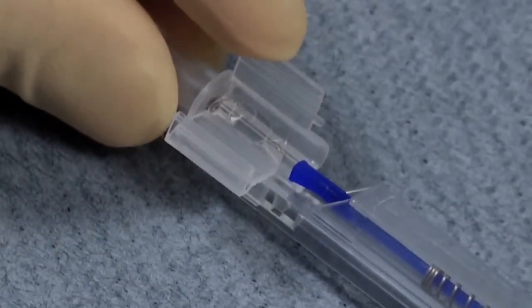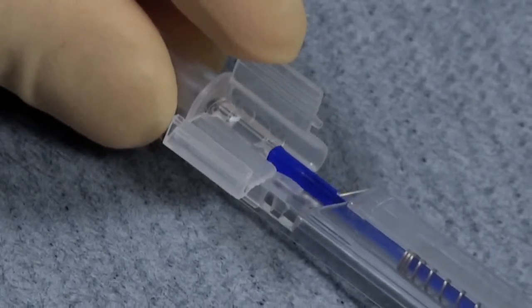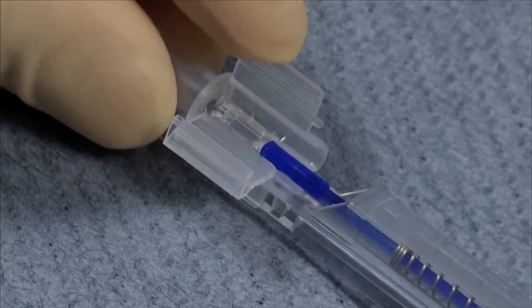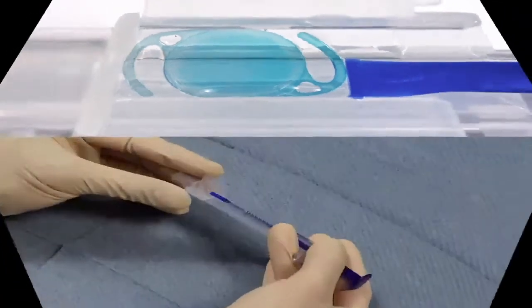Slightly close the cartridge wings to hold the lens in place, and then advance the plunger such that the haptics are compressed as shown. The compression is correct when the haptic is pointing toward but not touching the optic.